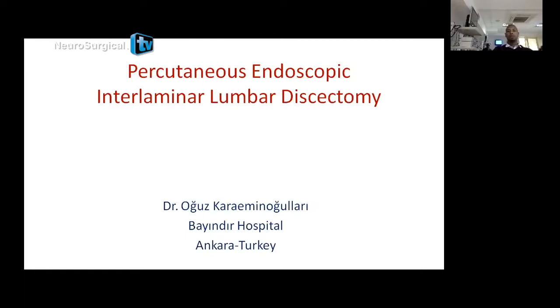Let's look at some questions. I will now explain the technique, or on a cadaver, whatever you want. I think it's better now to do it theoretically because the cadaver might be a challenge. We're going to try, but it might be a challenge.